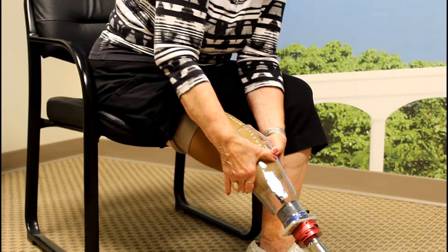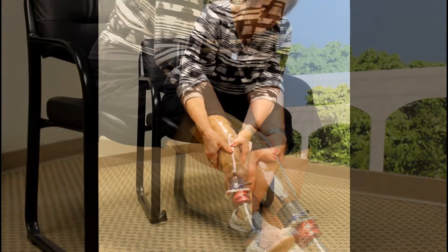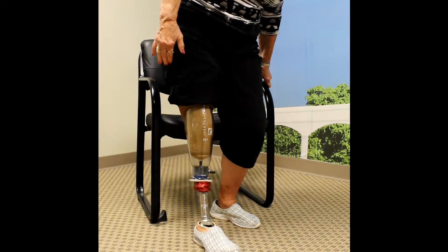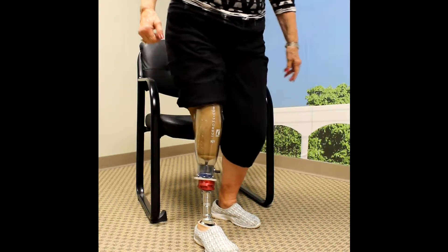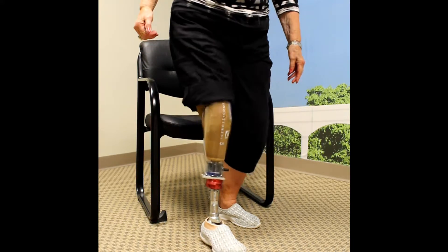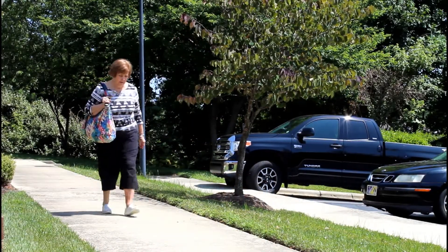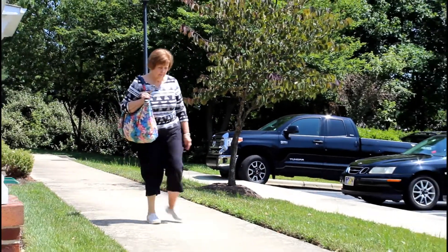If you choose to get clicks while standing, remember that the prosthesis is not attached to your body until the pin clicks into the lock at least once. Once you hear a click or two, carefully stand and shift your body weight to the prosthetic. You will hear the system click several more times and then stop. When the clicks stop, you are completely in your prosthetic socket. You may now proceed with walking and other activities.